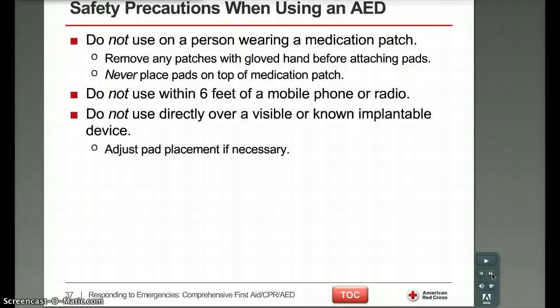Do not use directly over a visible or known implantable device. So if somebody has a pacemaker or something in, you don't want to put it over the top of that device because it's going to, once again, have a hard time analyzing and reading the electrical activity of the heart. So we'd have to just adjust the pad placement. We know we have a pad in the upper right and the lower left. If we have to adjust that a little bit, that's going to be okay.